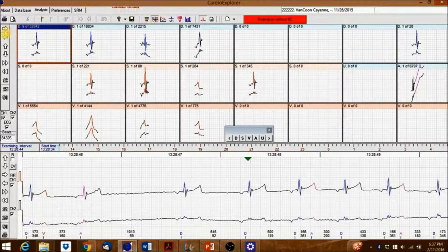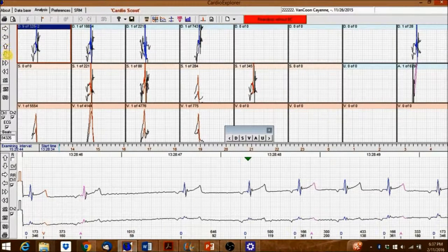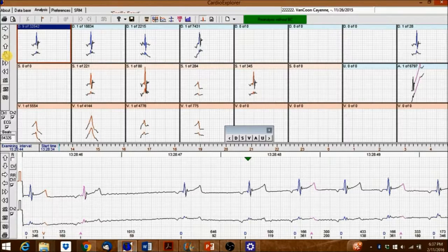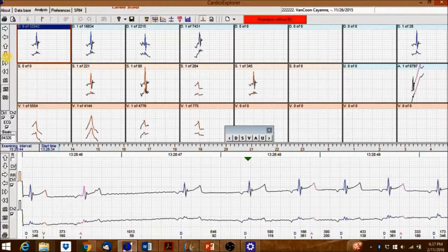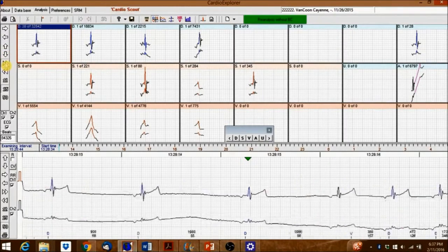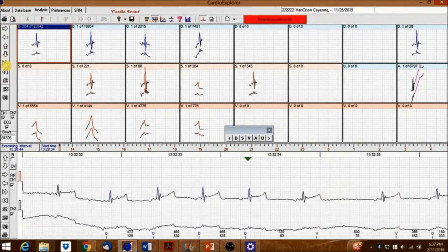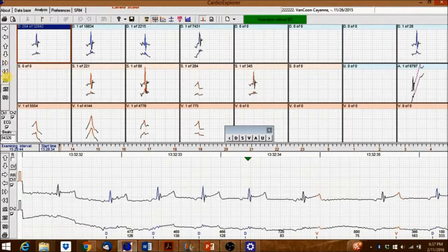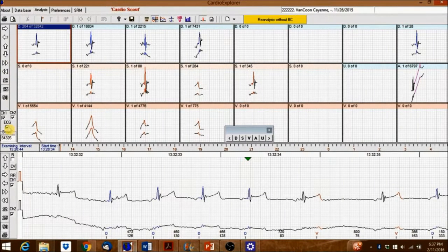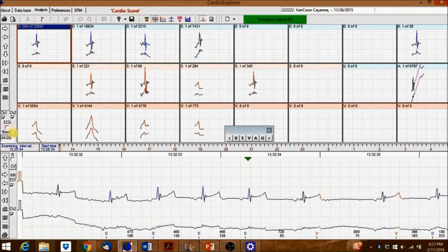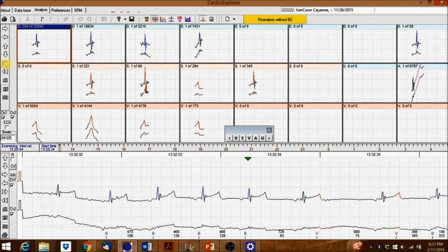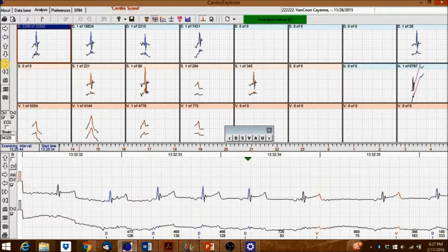The up and down arrows increase and decrease the amplitude. The double right arrows play the ECG in both the beat window and signal window below. Uncheck the ECG icon to only play the recording inside the small beat window.